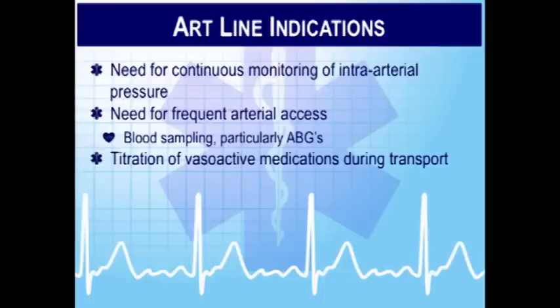All right? We compare the cuff pressure with the arterial line. And what we generally say is if the cuff pressure is within 20 millimeters of mercury of an arterial line, I believe them. They're accurate. All right? If I was you and I'm transporting a critically ill patient, here's what I'd do. I'd walk into that room and I would check to make sure I have enough saline in that bag, that bag is pumped up to 300 millimeters of mercury. I would level and zero it to my monitor when I get them hooked up, and I would do a square waveform test at the very beginning so that I know that during that transport, I can believe what I'm seeing on the monitor. All right?